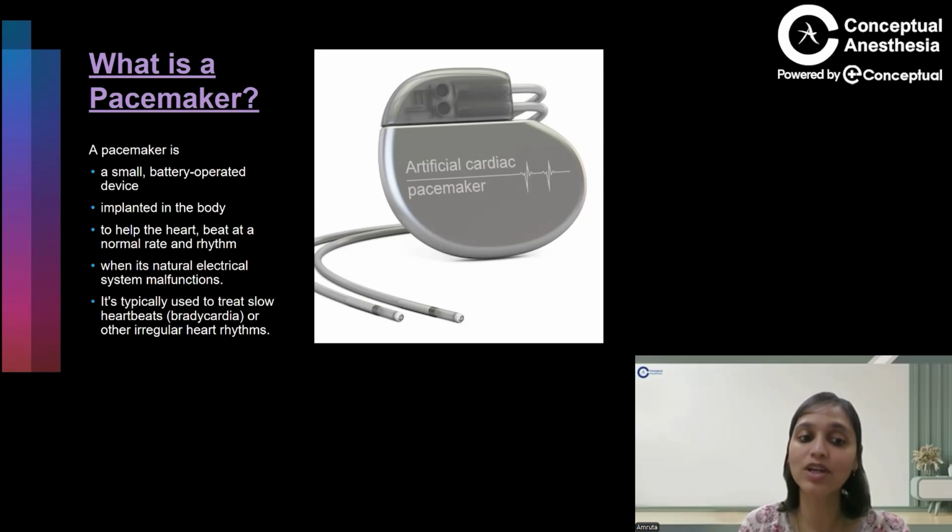One is when you have a slow heartbeat and you need to pace it to get it within the normal range, or when it is so high that you need to overpower it. This is a pacemaker. In addition to this comes a defibrillator, which does the function of stopping your arrhythmias by giving a shock.